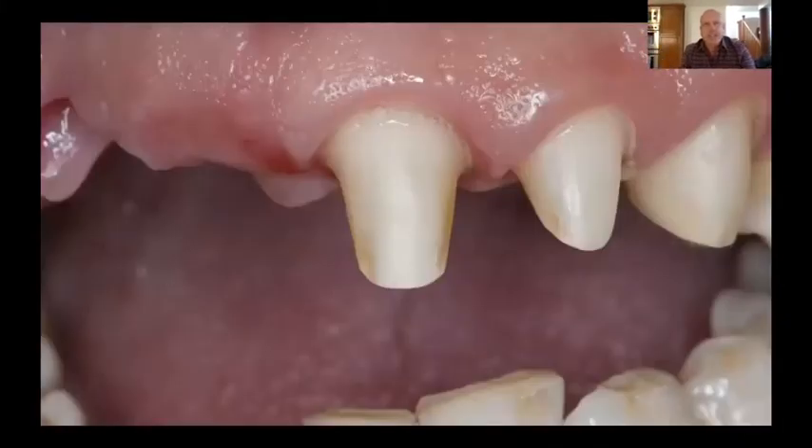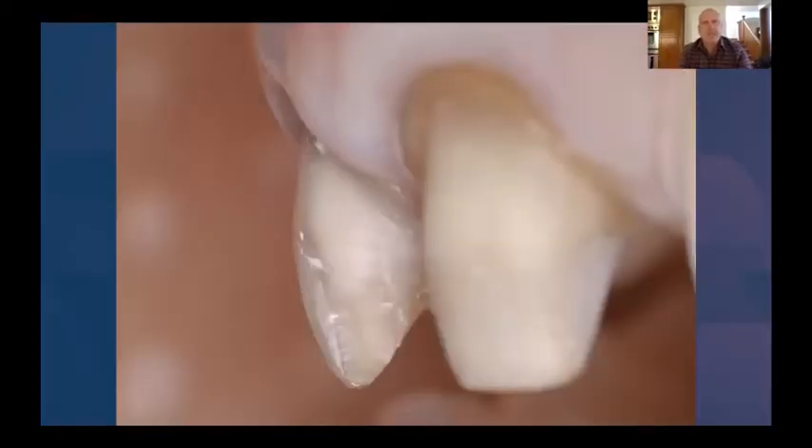For example, this prep that you see here — the central incisor — I should never be able to prep that with my left hand. And I couldn't for the first 10 or 15 years of my career, at least not consistently. Or if you look at this anterior prep from the side, you see three distinct planes: a gingival third, a middle third, and then that incisal third and how it's prepped back towards the palatal, towards the lingual. That's one of the big mistakes I used to make on anterior preparations — having bucky beaver preparations where the incisal third was still kicked out to the facial. If you haven't removed enough tooth structure, there's just no way that any technician can give you an aesthetic restoration back.